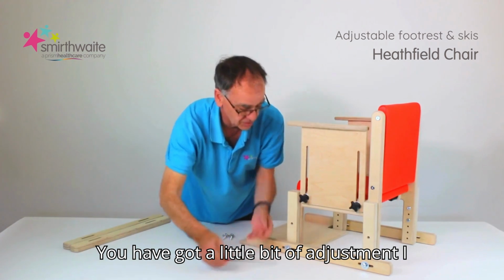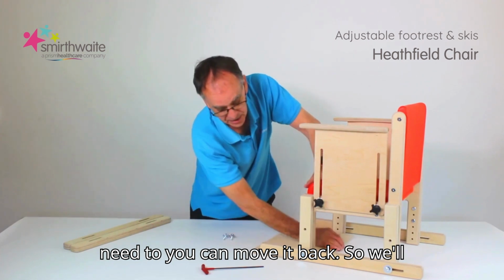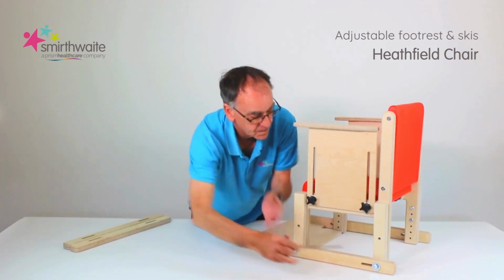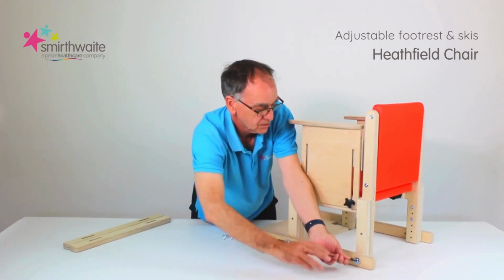You have got a little bit of adjustment, I should just point out, so you can move the footboard slightly forward, or if you need to, you can move it back. So we'll just have it in the forward position. Tighten up on this side.